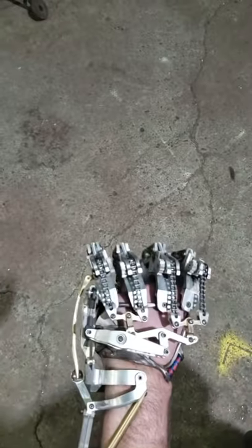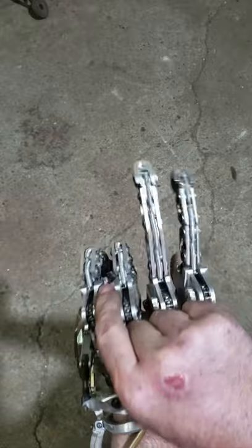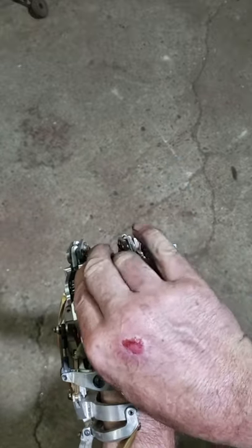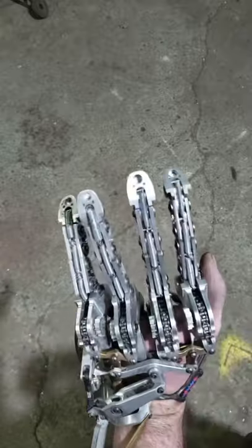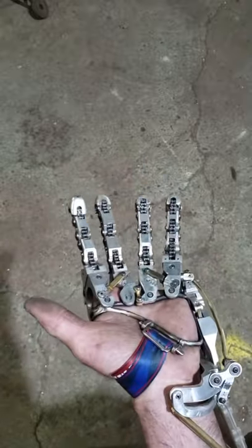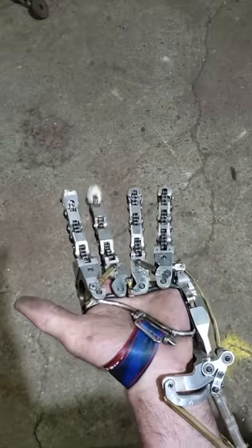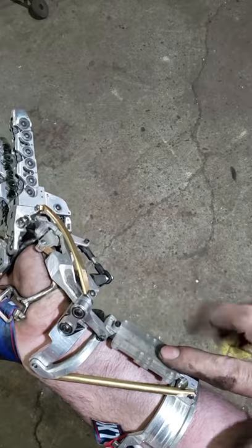In the next couple of weeks I'll be installing the electronics to engage and disengage these clutch bearings, and that will allow me to individually lock and unlock fingers. So I'll be able to grasp things and then be able to move my wrist afterwards, and that's going to be done through EMG amplifiers mounted on the forearm.